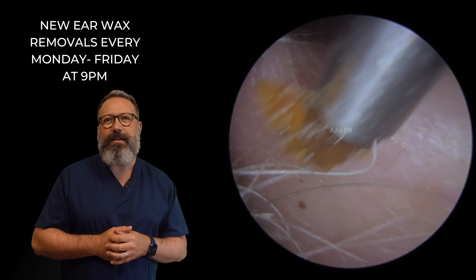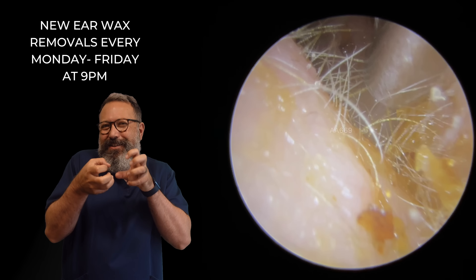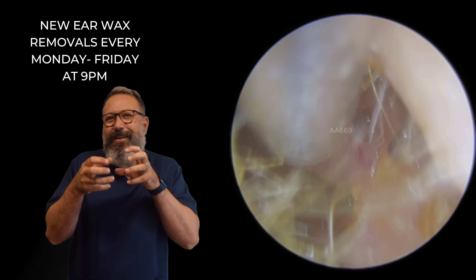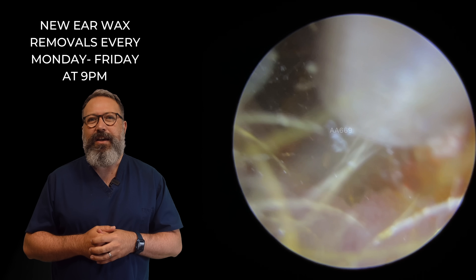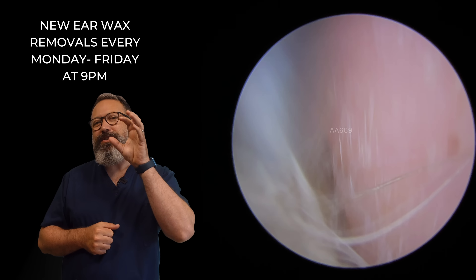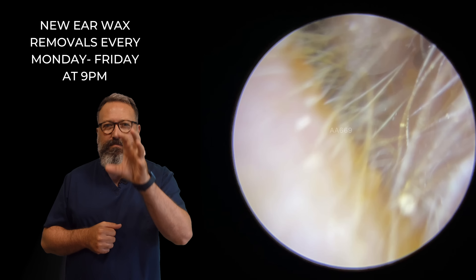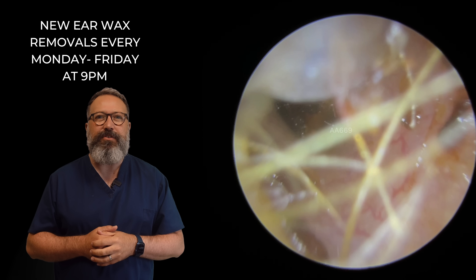There we go — out that comes. You can see it's almost going inside the suction tube, but it's not quite — it's just a little bit too wide to go up the suction tube. We've got this long, flat piece of wax here, just stuck to that bottom left corner. That's going to come out. Now I can see a much deeper section of wax, much, much further in. So let's get rid of all these little pieces here at the entrance.